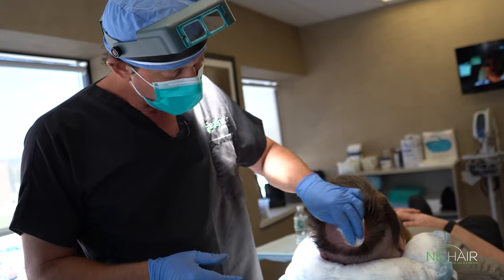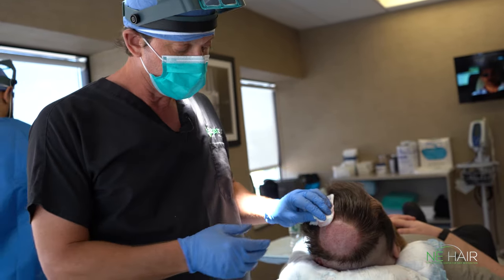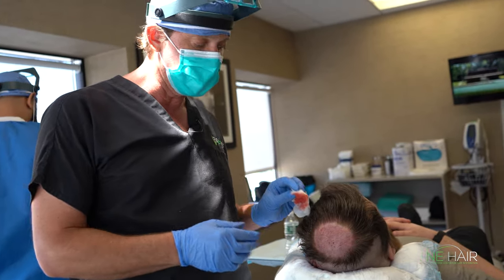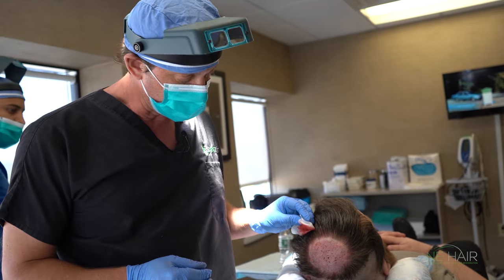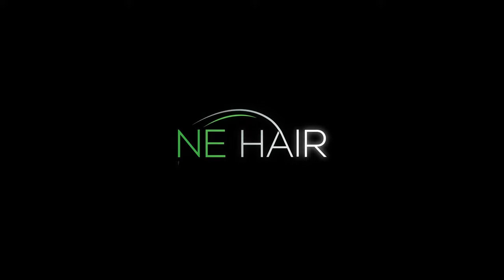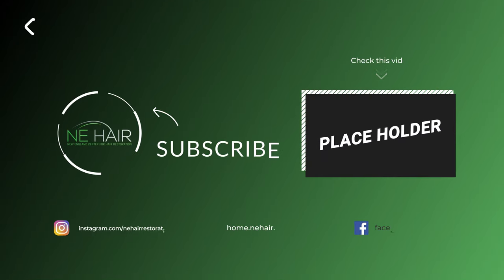We're done making all the incisions for the graft sites. The next thing we're going to do is put all the grafts in place. We'll come back and have a look at the graft site once they're all done.